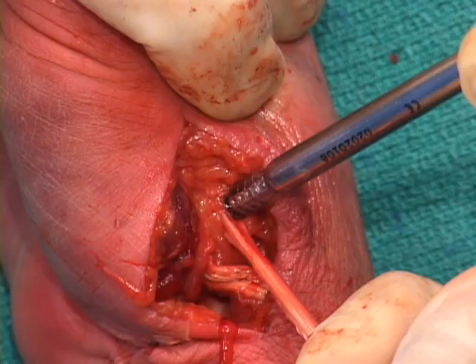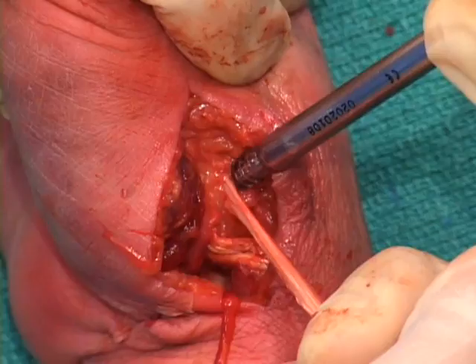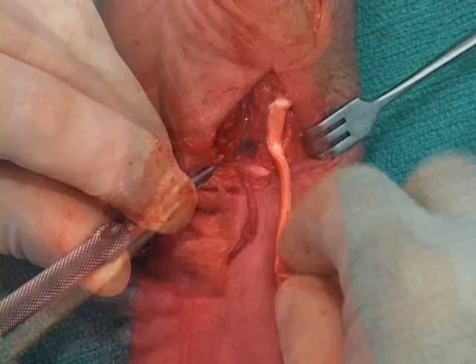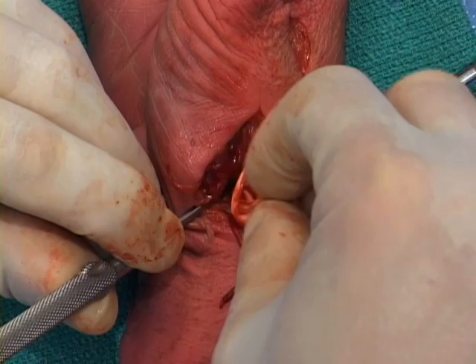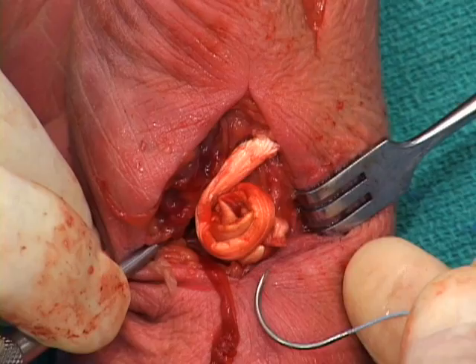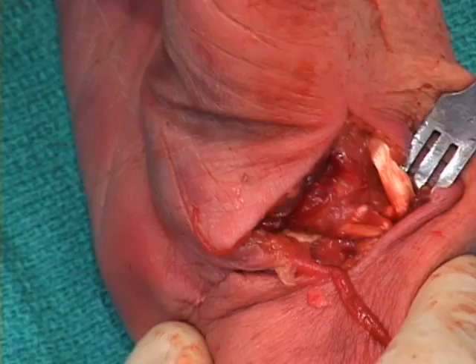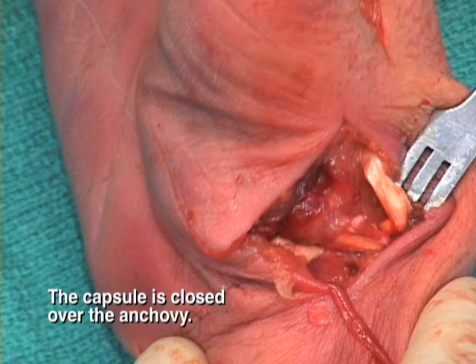Radial and slightly proximal tension is maintained throughout the insertion of the tenodesis screw. The excess FCR tendon may be cut off as it exits the radial side of the thumb and discarded, or it may be rolled or folded upon itself to create an anchovy for the trapezial space. The interpositional tendon spacer is sutured together to create a more substantial cushion for the metacarpal base, and may be fixed to either the deep capsule or anchored to the bone. Closure may be done with 3.0 or 4.0 fiber wire with a portion of the FCR incorporated into it. Post-op protocol is per surgeon preference.